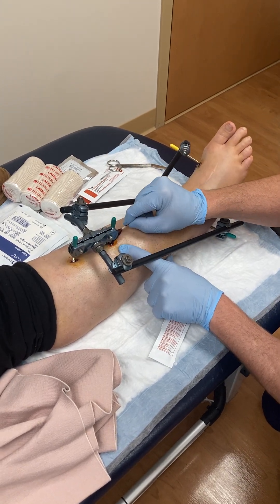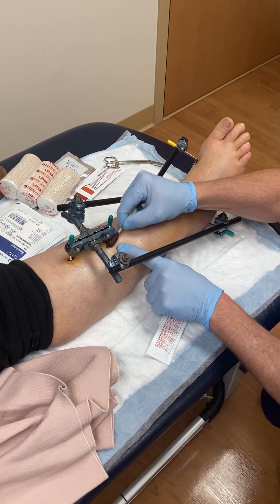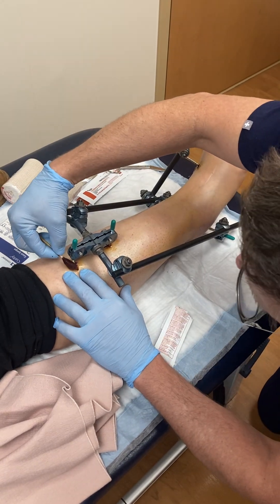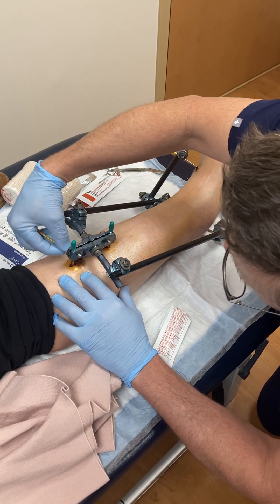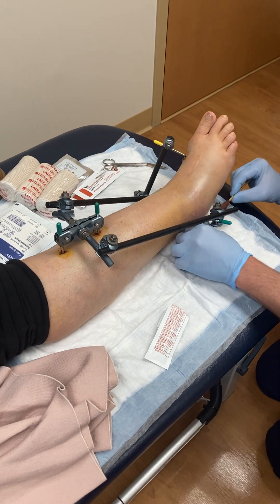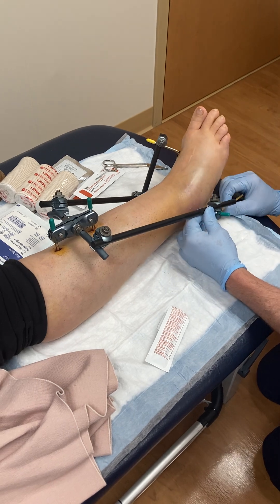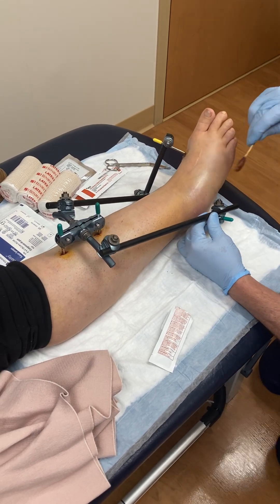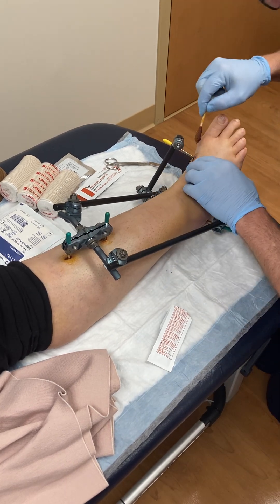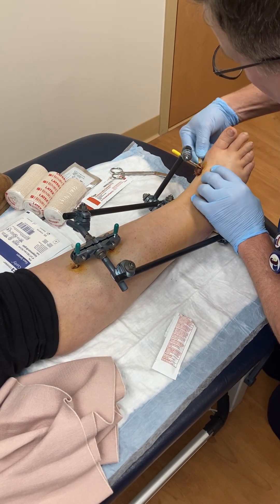What I do is clean right around these pin sites. I like to use sterile betadine swabs, and I push the skin back away from the frame — pushing the skin towards the center of the limb, away from the pin. This is not overly uncomfortable for most people, though honestly the idea of having this erector-set external fixator can make some people a little uneasy. I go all around every one of these pin-skin interfaces so that we don't have infection working its way in.